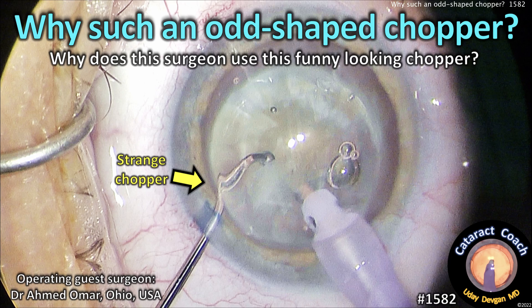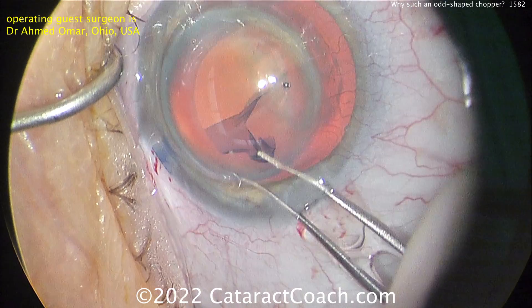CataractCoach.com. Why such an odd-shaped chopper? So why does this surgeon use this funny-looking instrument during surgery? Let's look at this case carefully here.